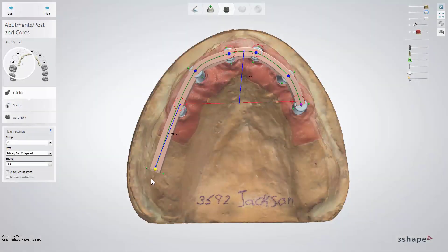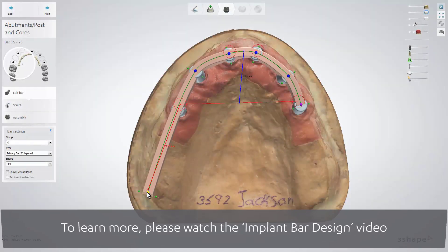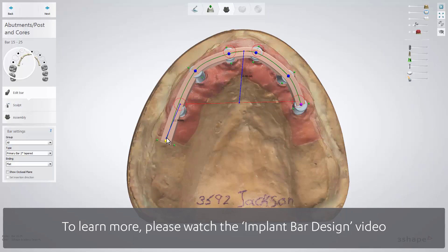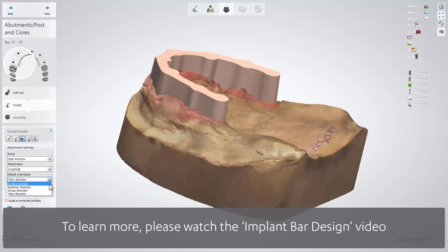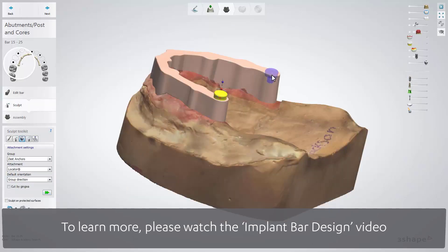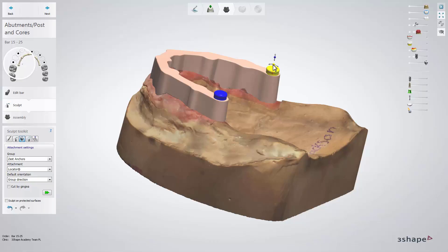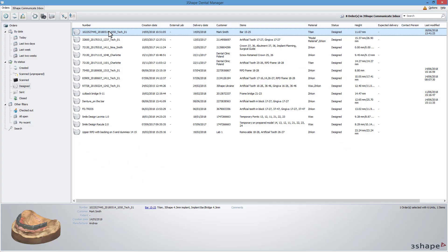In this video, we'll show you how to design a secondary bar. First, you need to design the bar — to see how to do that, please watch our video. When this is done, you can use the Copy and Append option to create the secondary bar design. The position and insertion of attachments for the secondary construction will be used from the primary construction.